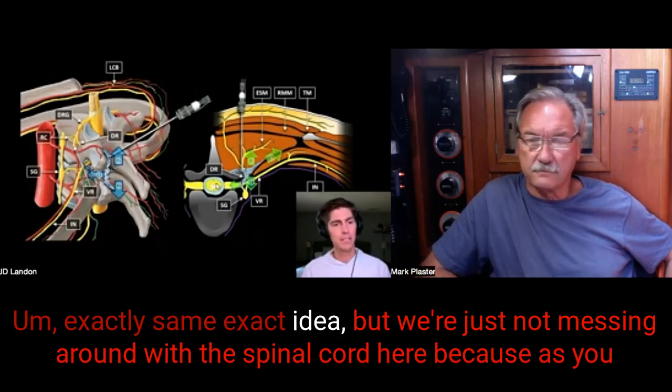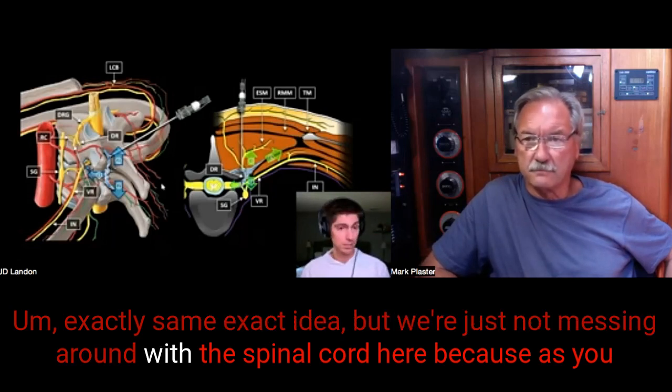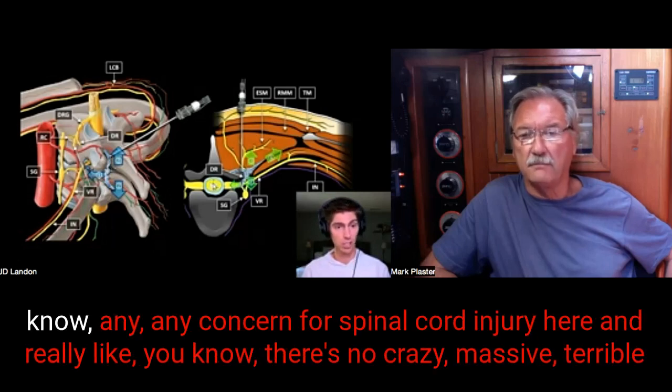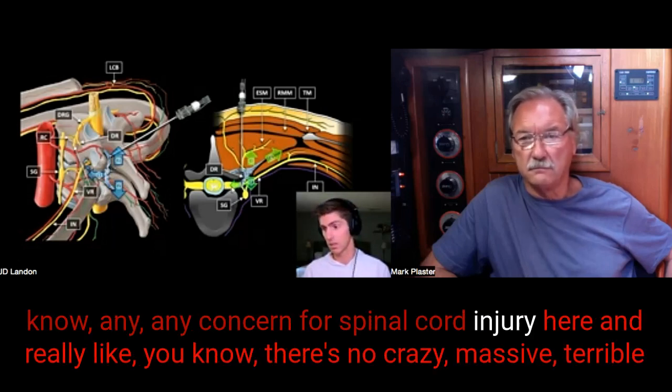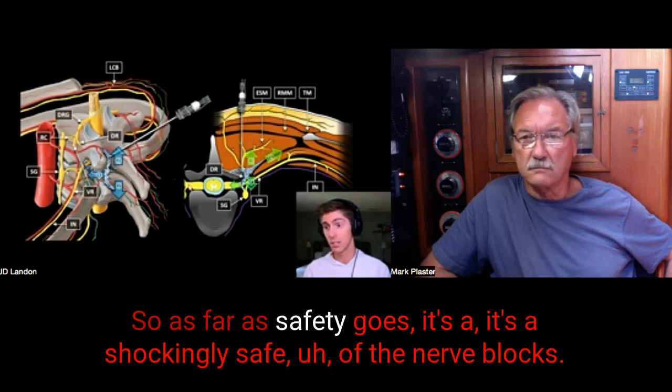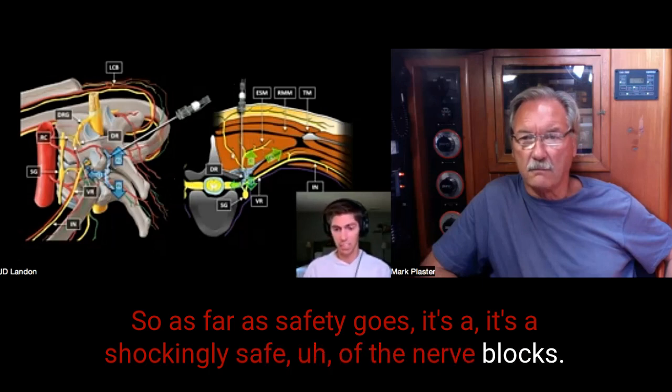It's almost like an epidural, the exact same idea, but we're just not messing around with the spinal cord here because as you can see, with the angle we're going, we're really quite protected from any concern for spinal cord injury here. And really, there are no crazy massive blood vessels coming in through the muscle that we have to worry about either. So as far as safety goes, it's a shockingly safe nerve block. It's a pretty safe one.